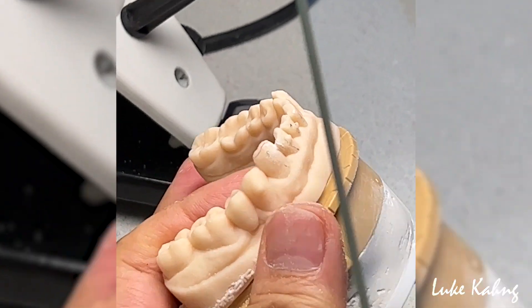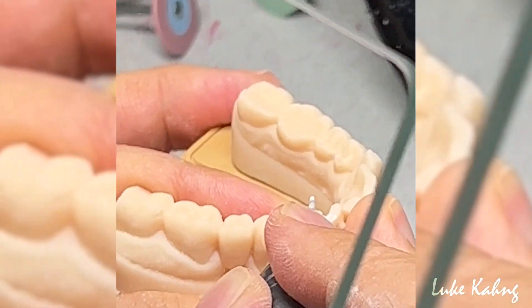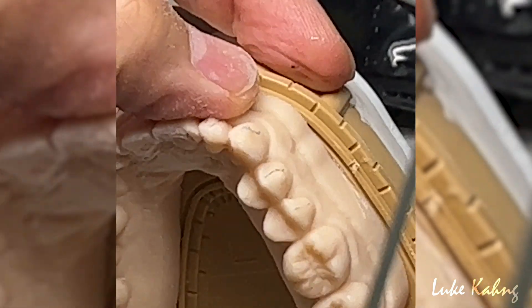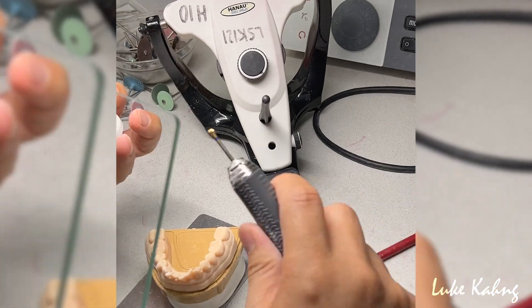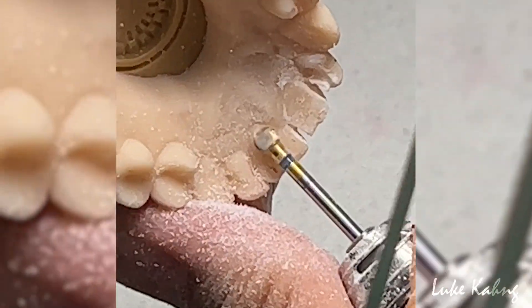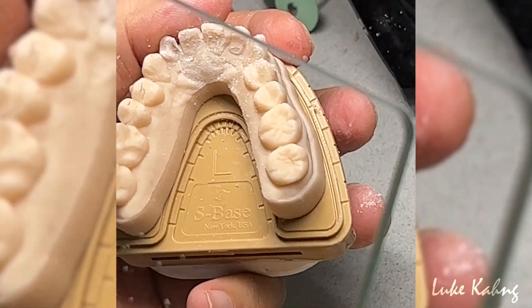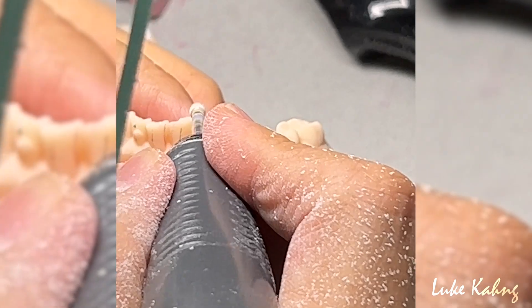I'm going to decrease a little bit. Here is less — this is normal contour. I think this is proper length, so I can add more here. I have to grind more here, then I can use more — the football shape. Just a little trim, especially this. I do have room, pretty much. Then I can grind a little bit here — one millimeter. I can grind a lot. Now I can trim it just a little bit.